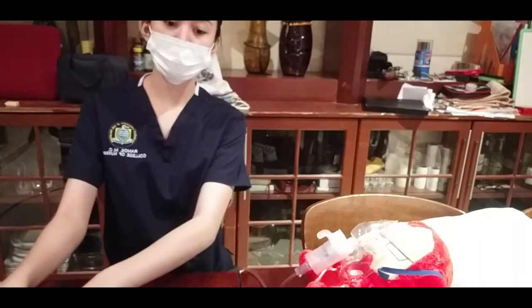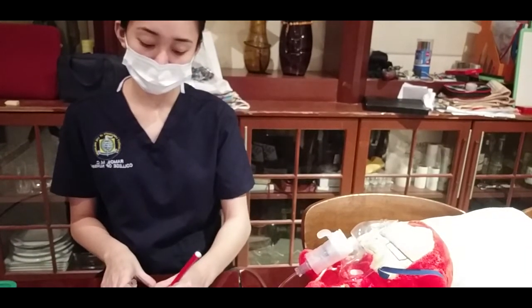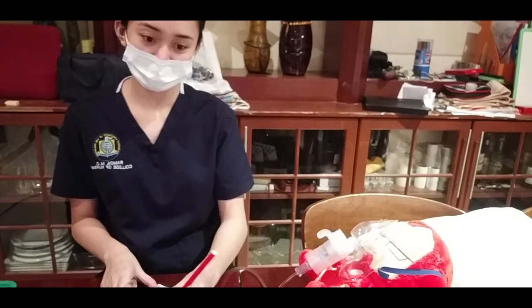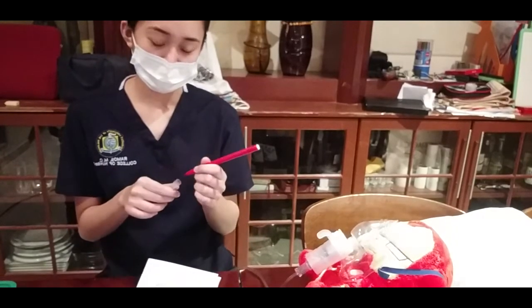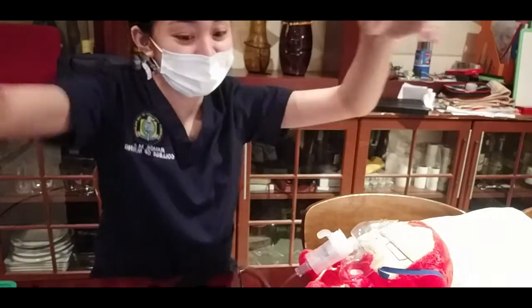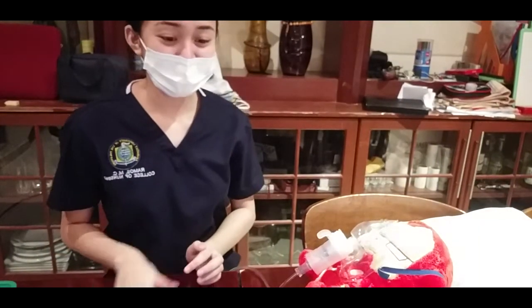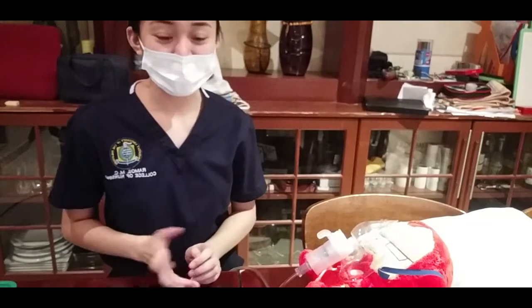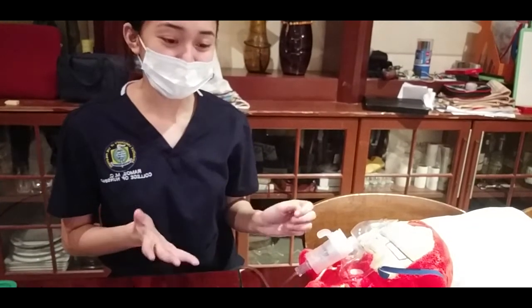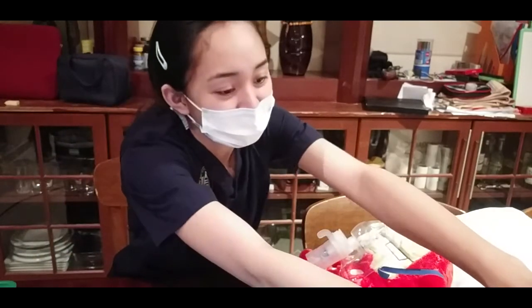And next I will be posting an oxygen in use sign at the door, to let the visitors and other workers in the hospital know that oxygen is used inside the room. Next, I will be performing hand hygiene.